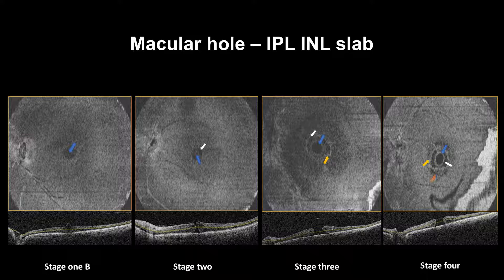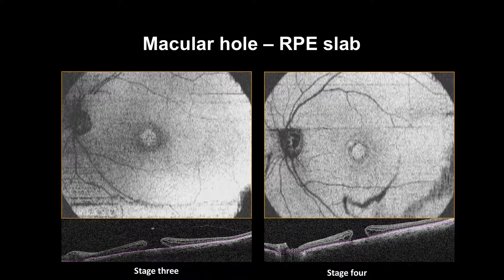Stage 4 may show hyperreflective highlighting. The cystic changes can arrange in a symmetrical petaloid pattern, differentiating it from the pseudo and lamellar hole. Please note the blink and segmentation artifacts. The RPE slab will show projection artifacts and RPE alterations that look like hyperreflective lesions, along with alterations in the form of hyperreflectivity at the level of photoreceptor layers in manually adjusted slabs. Please note the blink and motion artifacts.